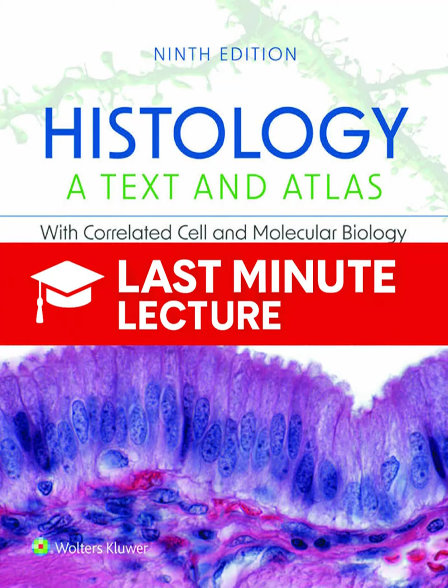When we apply these antibodies to tissue, we have two main ways to see them, direct and indirect. Right. Direct immunofluorescence, which you can see in figure 1.5a, is the simplest method. The fluorescent dye is attached directly to the primary antibody that binds the antigen. It's just one step, very quick. But the drawback is a weak signal. A very low signal intensity because you only get one fluorescent molecule for every one antigen molecule.